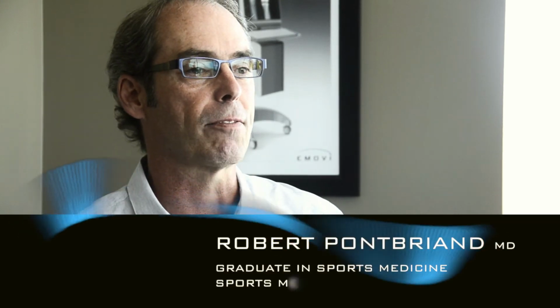The KneeKG in my practice is definitely a functional tool that has been brought to us to help the process of evaluating and following either an injury or a state of the knee, for example osteoarthritis, which is definitely a problem to treat and to follow.